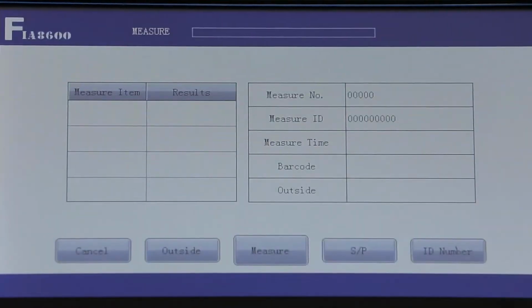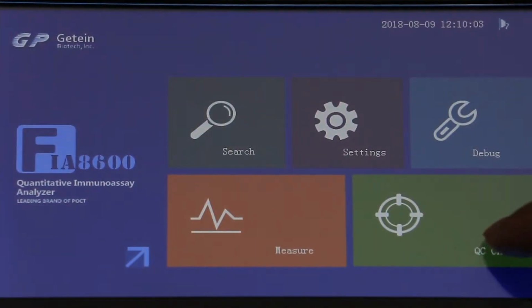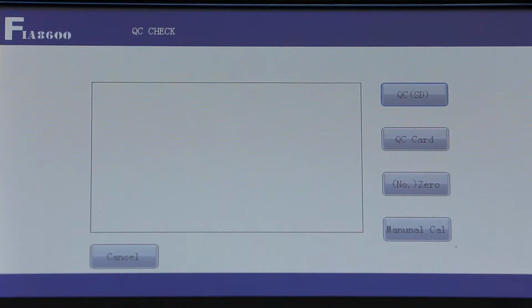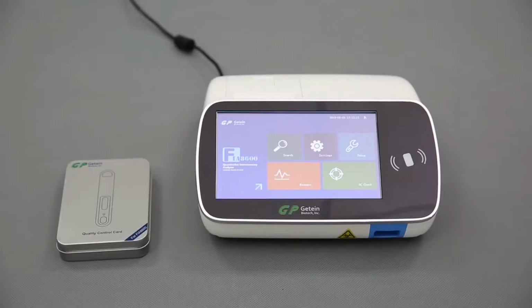ID number, panel mode, and sample mode can be set on the interface of Measure. Click QC Check to set internal parameters of the instrument to ensure accuracy. It is recommended to perform quality control with the QC card every other month to ensure correct operation.